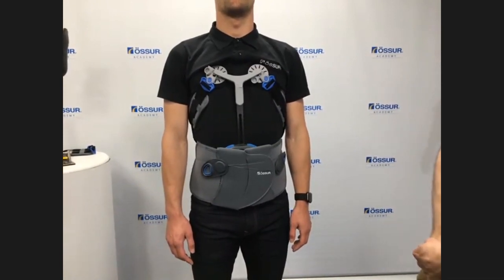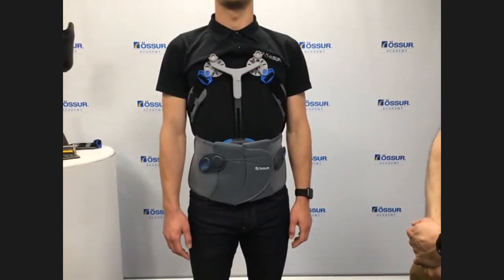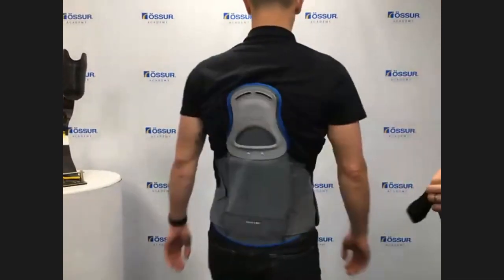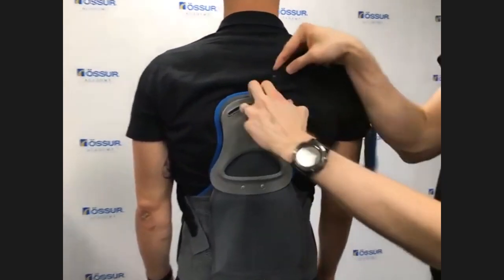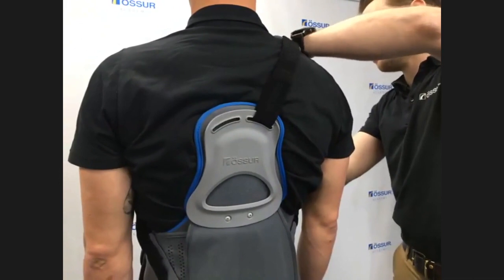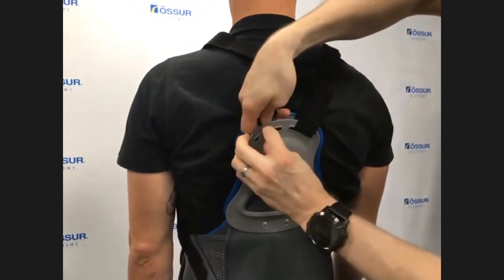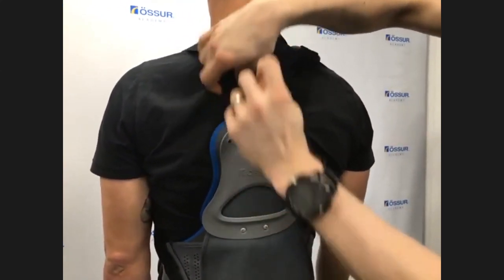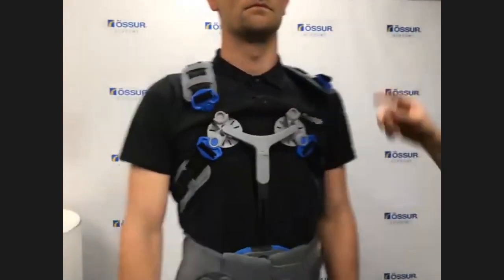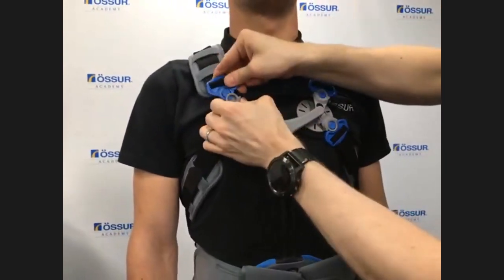So to do this, we order the extra kit, which includes these two clips, which I've already added in. I showed you right at the start. And we can then add these two extra straps, which are either side. So if you spin around and face the other way, Pete, what I'm just going to do is slide these two sections in, like that. I'll just drop one of those straps, bear with me. Bring this over here like that, place that over the shoulder, adjust that one into position, and then fasten that over the top like that. And then if Pete spins around, what we can actually do is adjust the positions of the pad and clip those nicely into position there like that.